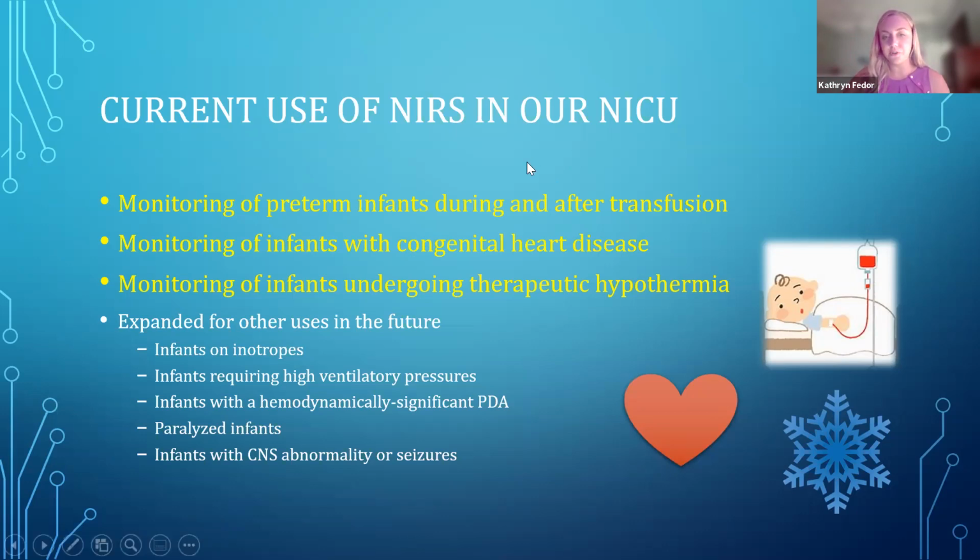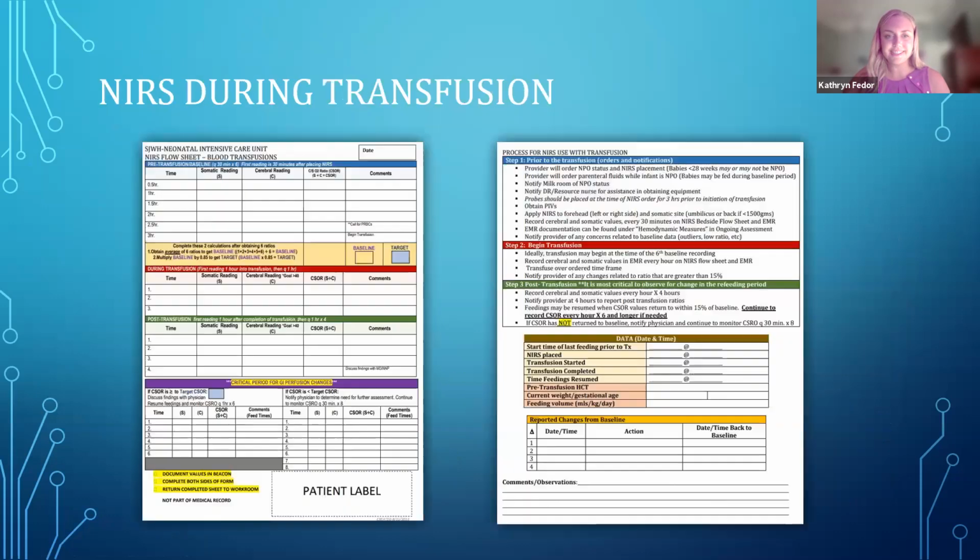We've learned a lot, like I said, on accident, monitoring infants for other reasons. And then paralyzed infants, we certainly believe it can provide us clues to what might be going on with their sedation levels. And then infants with CNS abnormality or seizures.